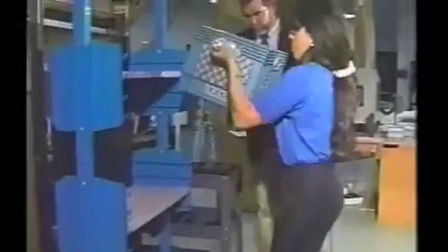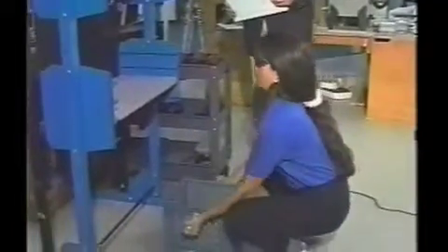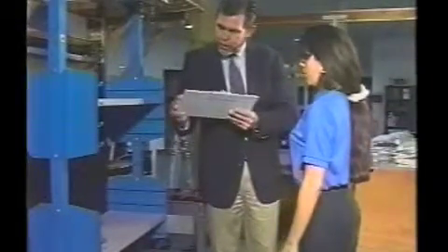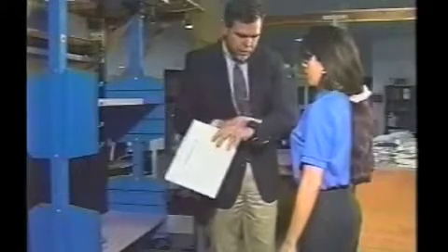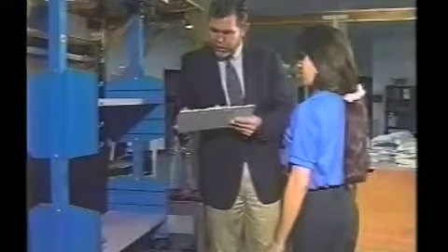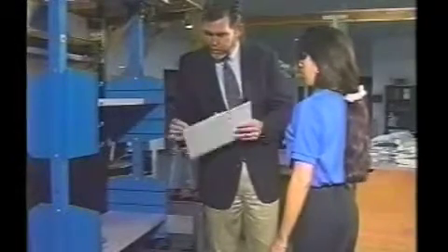And then back down again. Great — stand up and tell me how much that weighs. [Margaret: A three.] A three. Can you do that on a safe and dependable basis 8 to 12 times a day? [Margaret: Yes.] Can you handle more weight? [Margaret: Yes.]